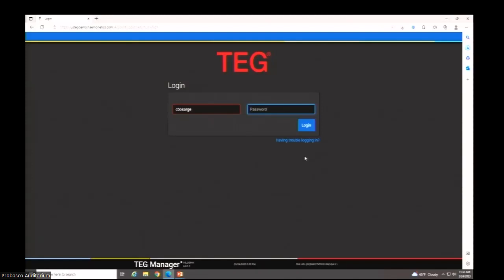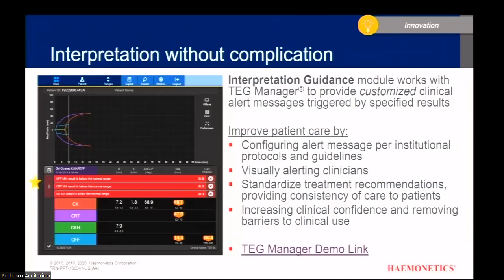Okay. Anyway, I don't want to take up all of your time here today, but it is in time order. The most recent tracings will populate up at the top. You can select today. It's very easy to navigate. I'll do a screen grab once I have the info about how we'll access it and share it with you guys. You can search by name, patient birth date, all the regular identifiers, or just by today. Knowing that you've just sent a sample, usually the workflow is to check the today box and then the most recent is right up at the top. So it's easy for you guys to get to. And again, those messages are something that your team can help create.